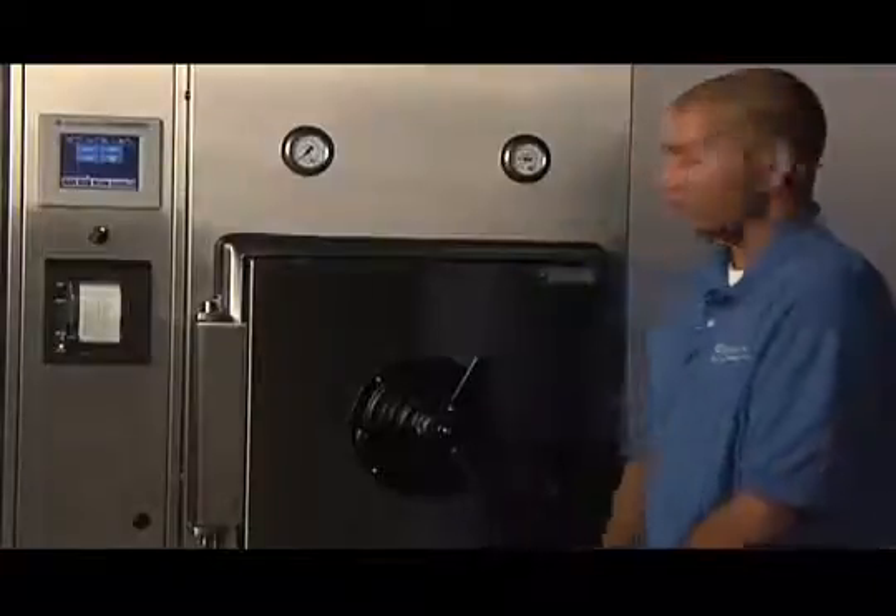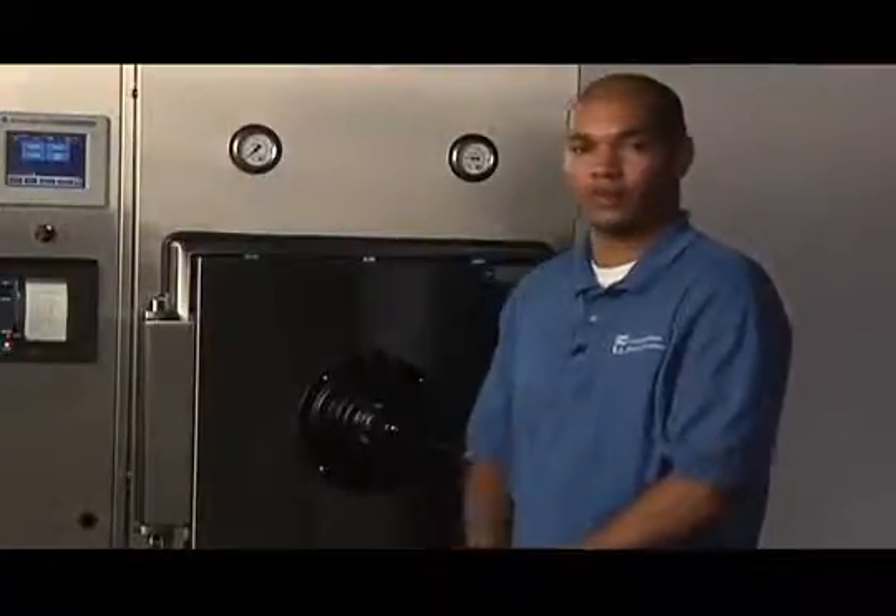Properly tightening the door is an easy procedure to follow. After loading your goods in the sterilizer, simply close the door and turn the handle to the right. The number of turns required to properly seal your door will vary from machine to machine and depends upon the state of wear of the door gasket.